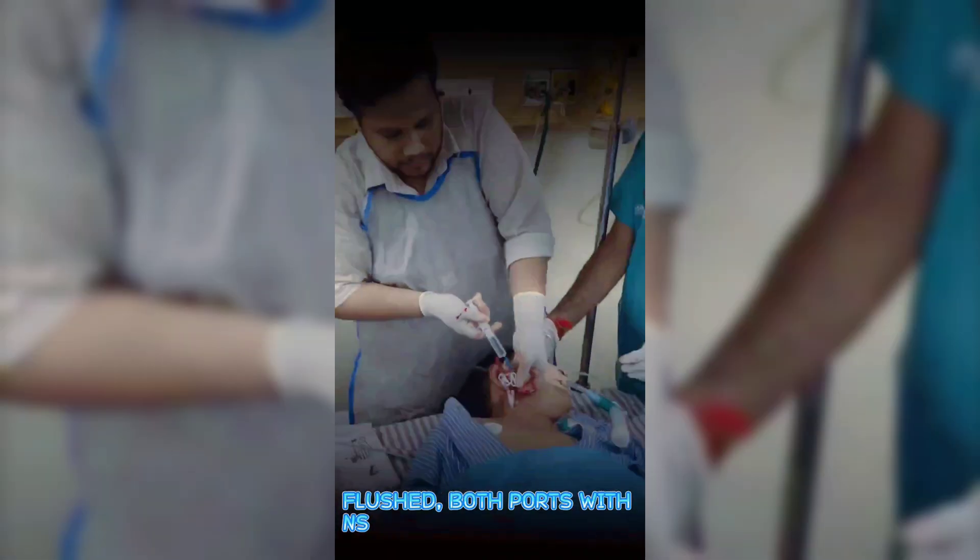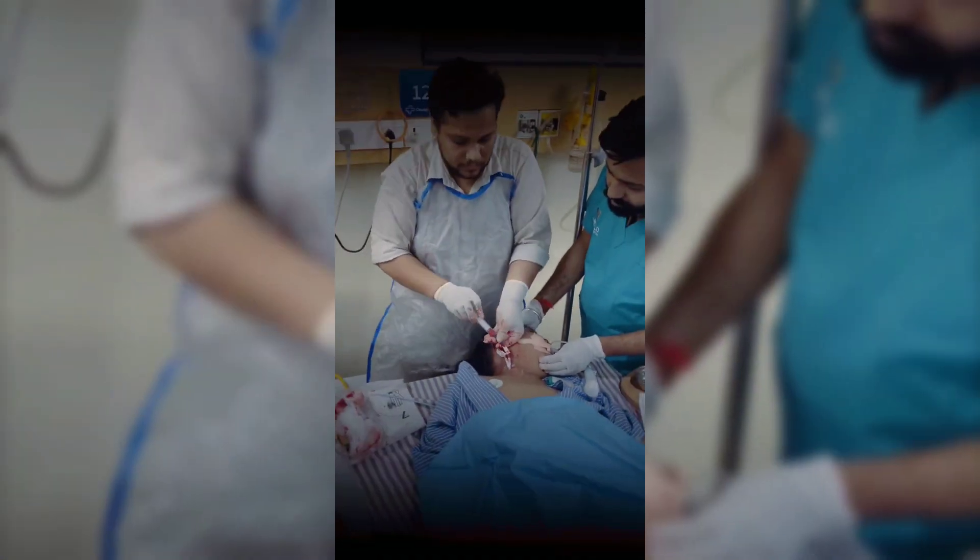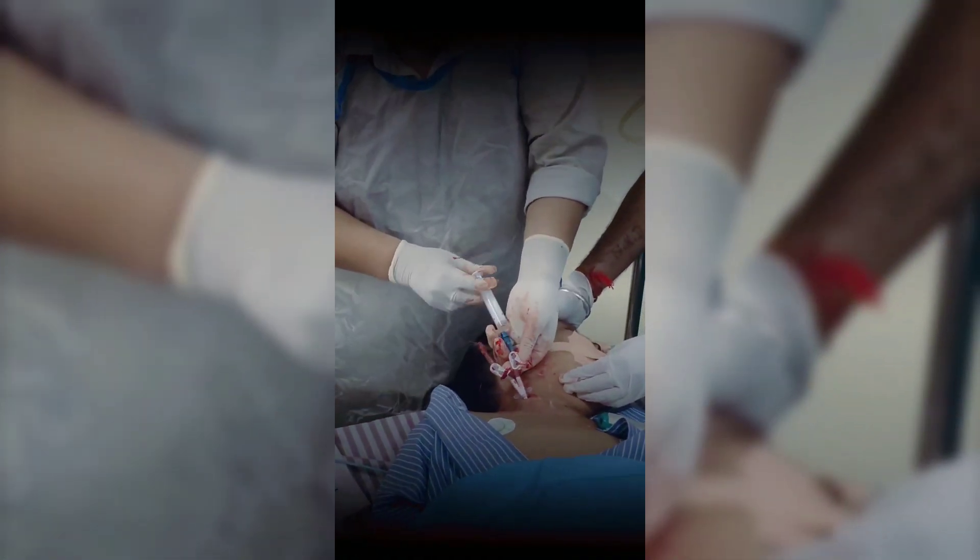Both ports are flushed with saline to confirm patency and clear the lines.